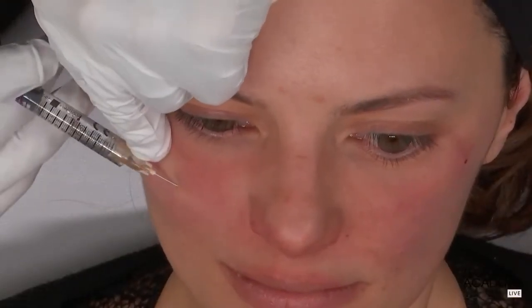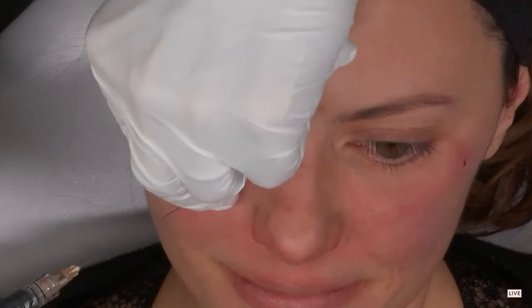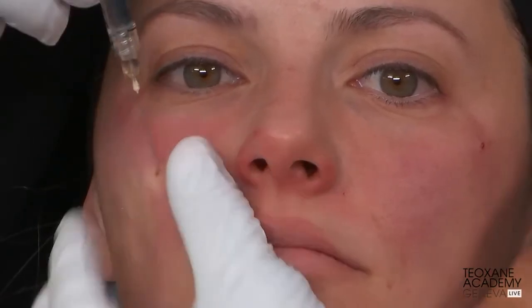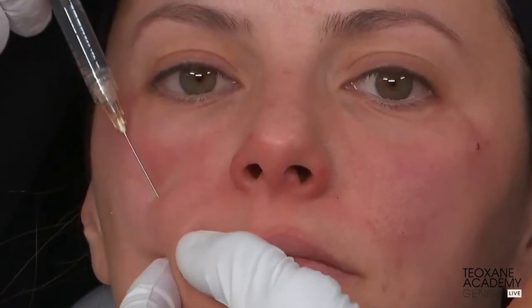And you are superficial. Look how superficial I am. And you don't see any lump or bump. That's the beauty of these products. This is a very dynamic area, but she has a fold. I have injected 0.2 cc from here to here, and the fold is already done. From the same entry point, you can direct your cannula superficially down to the bottom part of the nasolabial fold, and also down to the corner of the mouth, just to give support, and come back up. To top it off, it's looking much better already.